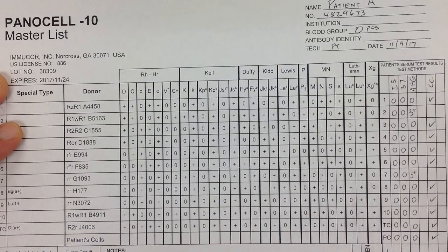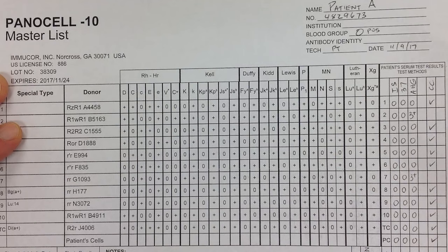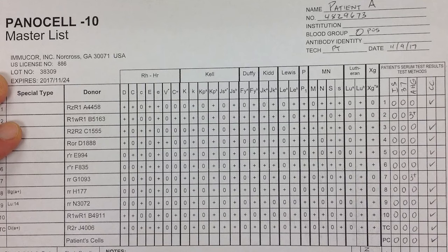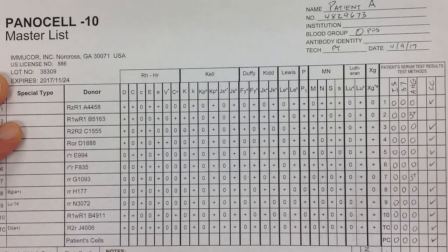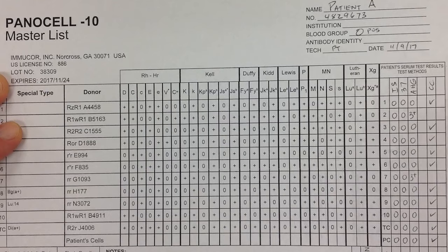We feel pretty confident that we don't have any interference or false positives due to any auto-antibody. Looking at the right-hand side, I can see no reactions at initial spin, no reactions at 37, and then a 3+ and another 3+ at the AHG phase. This gives us information that, if we're looking at a single antibody, it seems to be more of an IgG antibody, because IgM antibodies tend to react at initial spin and IgG tends to react at 37 degrees or at the AHG phase.